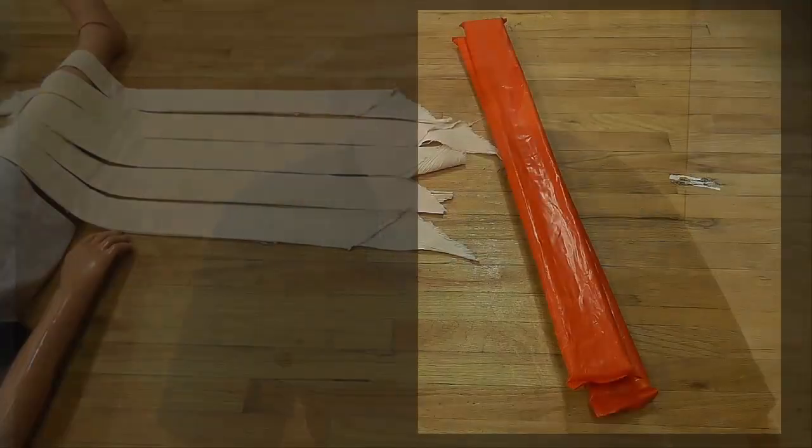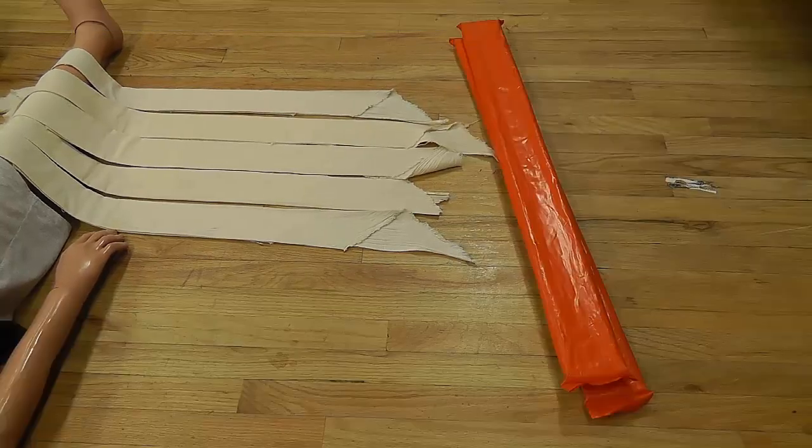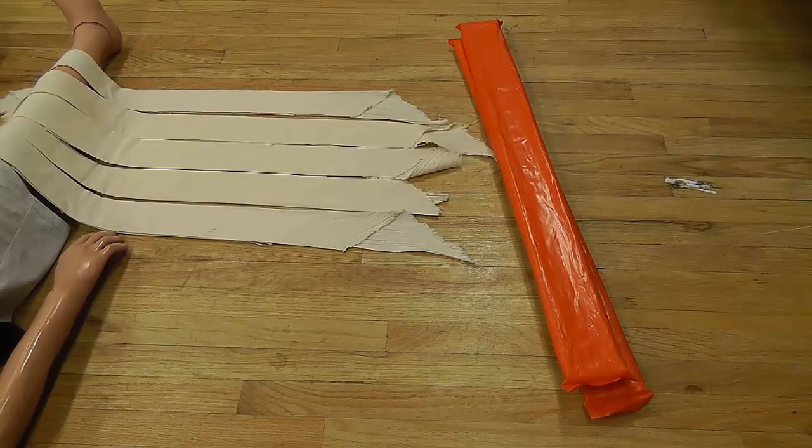Let's do it! In order to perform this skill correctly, you're going to need some equipment. What I have here today are two long padded board splints and five cravats. You're also going to need a helper to give you a hand with this skill, so I brought one of my co-instructors, Brandon, to give me a hand.